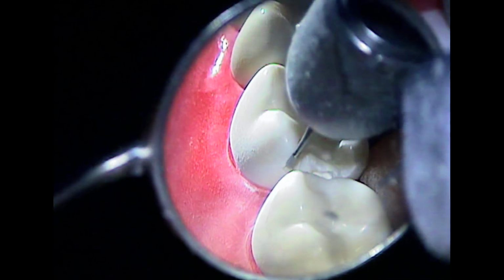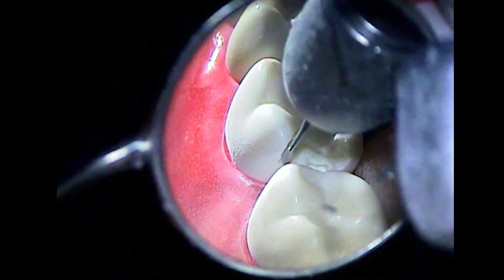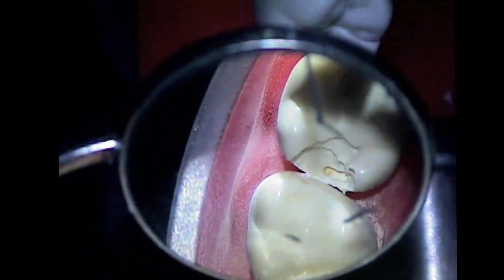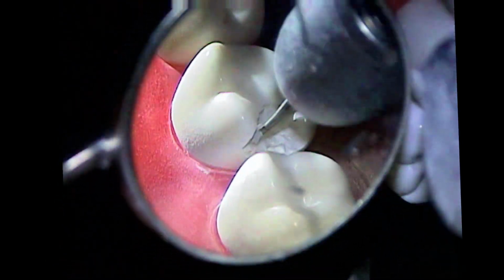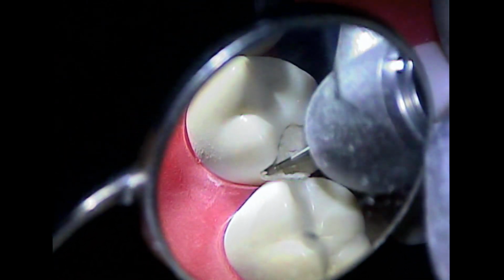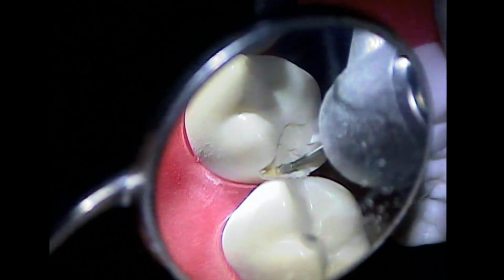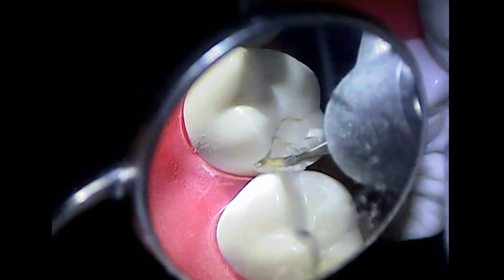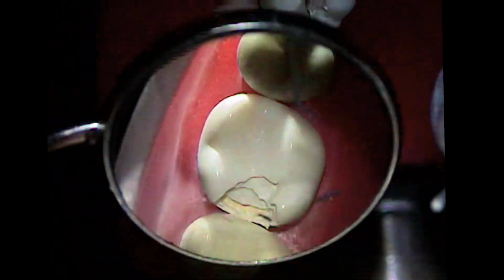So make sure you take your time and get a nice long straight wall, cut from the margin in. Adjust the angle until it's what you want, and then with the burr vertical, find your corner and drill a hole and cut away from that wall. Come down this wall, cut away from the wall, come down this wall, cut away from that wall. That's what we've been doing.